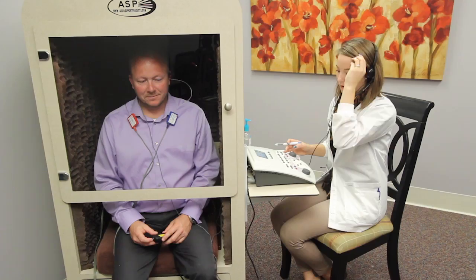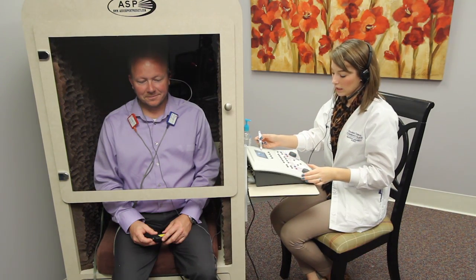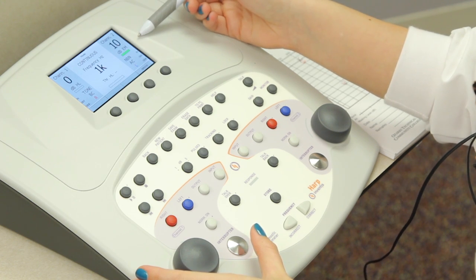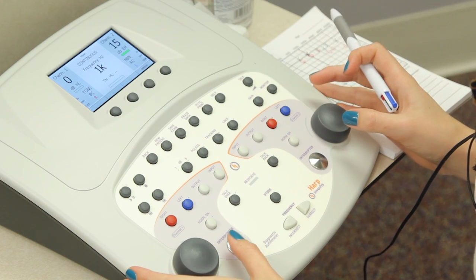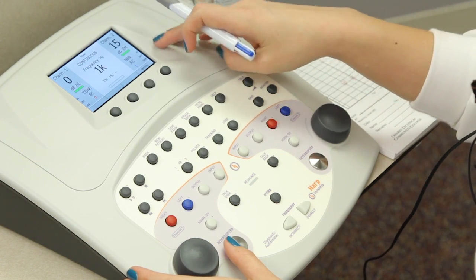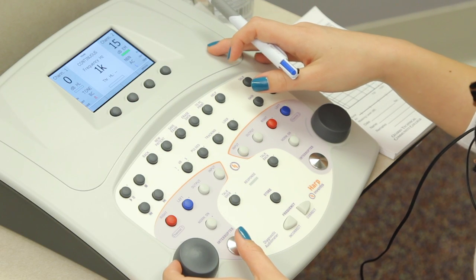So I found that his threshold is zero, and now what I'm going to do is called effective masking. That means I'm going to increase my masking level a total of 15 decibels in 5 decibel increments. I've increased my masking, and now the patient is not responding to the tone, so I'm going to have to raise my presentation level.